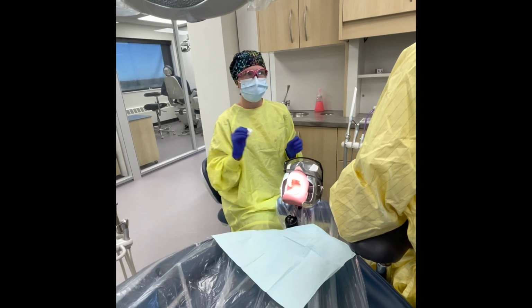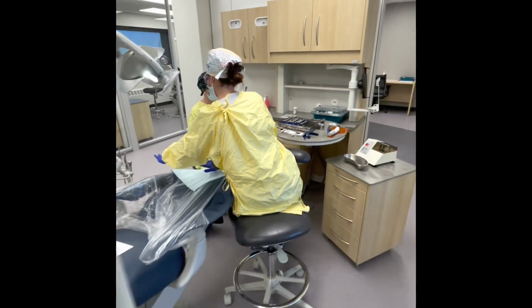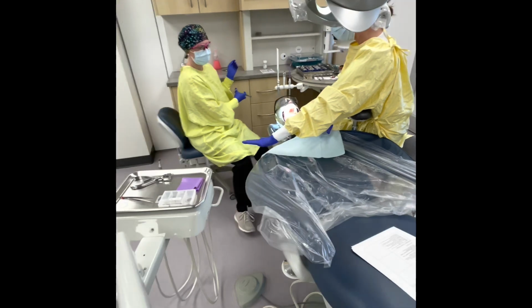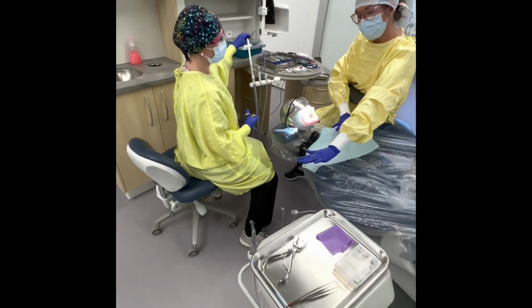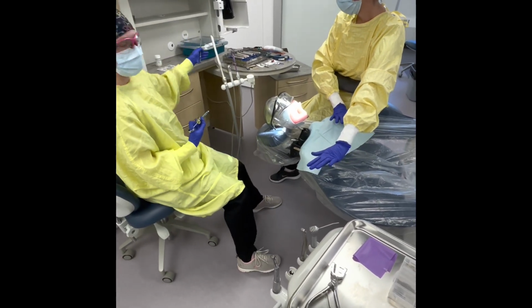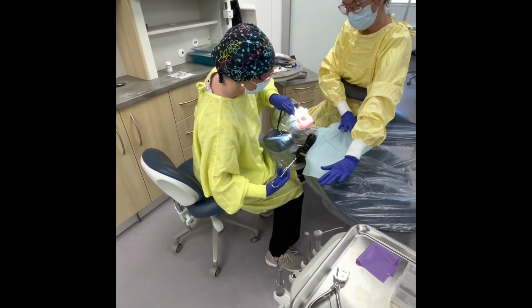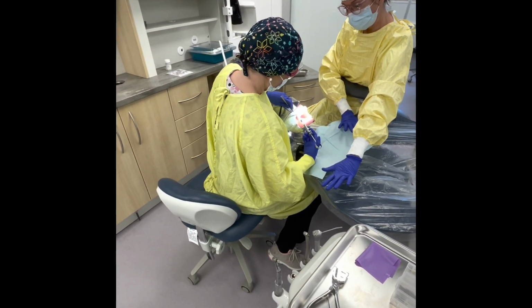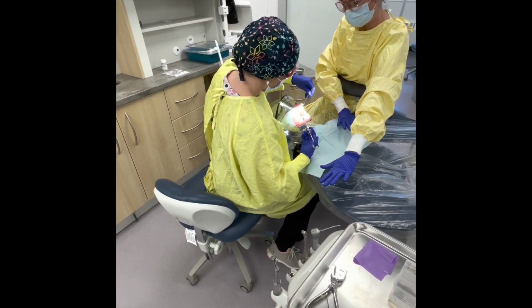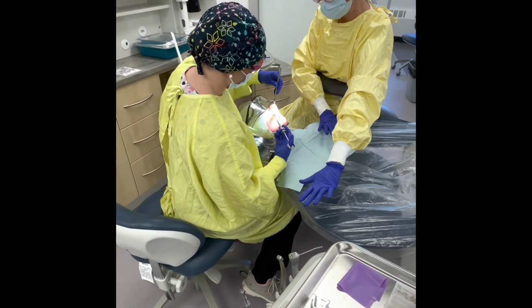So your operator will then just take your topical anesthetic and discard it. And I'm going to take my arms and cover the patient with them. I don't have to touch the patient, but I'm just going to guard them so that if they jump or put their arms up, Amanda is safe and she doesn't get hit. Okay, so your operator will take the syringe from the back of the counter and come around here. I will retract with my mirror and do my injections here. It's a very important safety note that Stacey has there, making sure that we are protecting the client as well as the operators, okay?